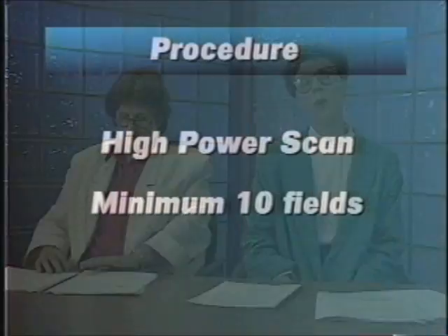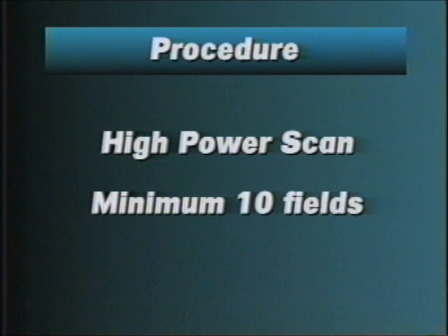And there are some abnormalities, such as Rouleaux and red cell agglutination, that are much more apparent on a low power scan. They will not show up as readily when you are right down looking at the red cells. It's sort of like the story of you can't see the forest because you're standing right in front of a tree. If you are so close to the red cells, you cannot always pick up these abnormal patterns like Rouleaux and agglutination. After you've done what I call window shopping under low power, then you need to go to a higher power to look more closely.